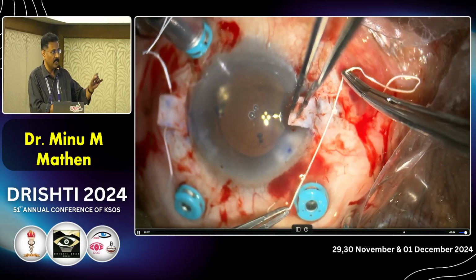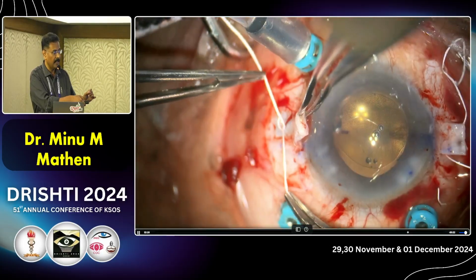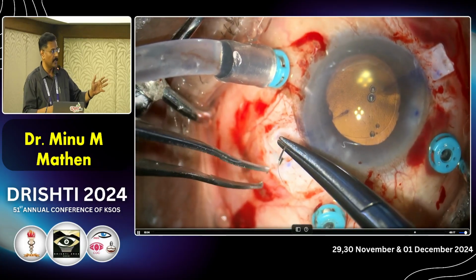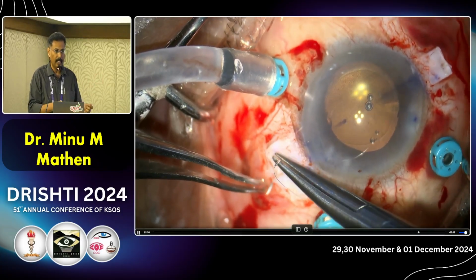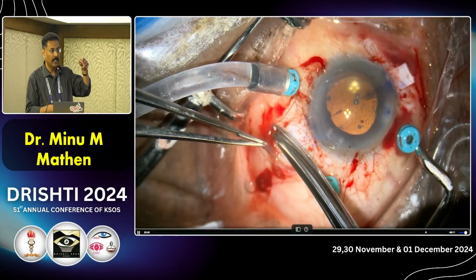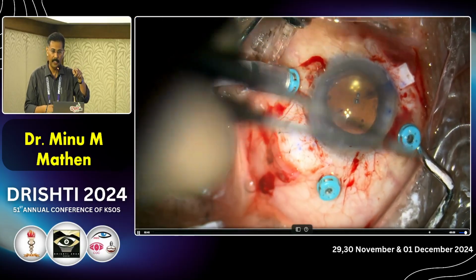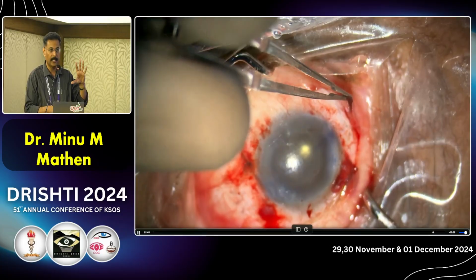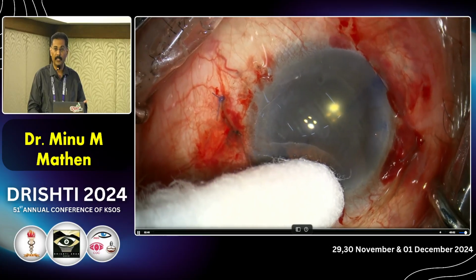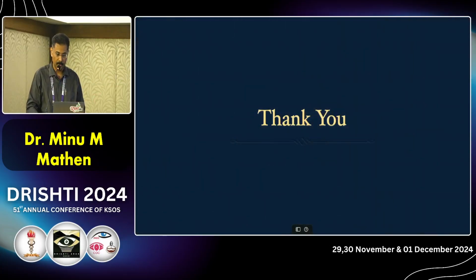One makes slip knots initially and makes the slip knot on the other side, and make sure you have not tightened it too much, and center the IOL well, looking at the Purkinje images, and then lock the knot. Then the knot has to be pushed through the sclerotomy which you have made, otherwise it will be too thick and it may erode through your flap. So this is another way to deal with the bag lens complex which is subluxated due to pseudoexfoliation.